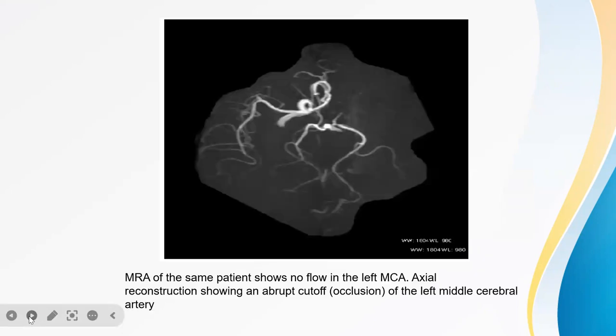This is an MR image of the same patient showing no flow in the left MCA. And this is an axial reconstruction showing an abrupt cutoff or occlusion of the left middle cerebral artery.